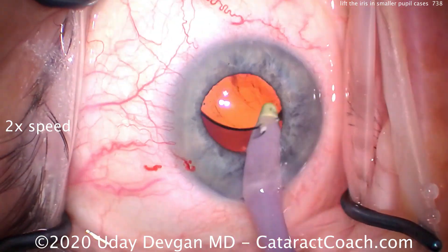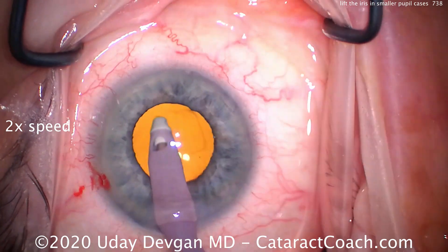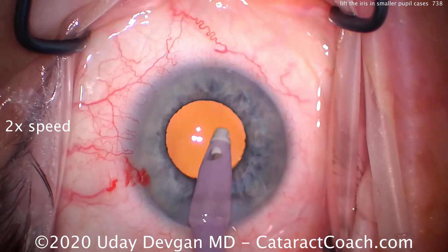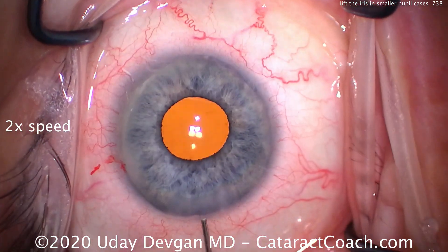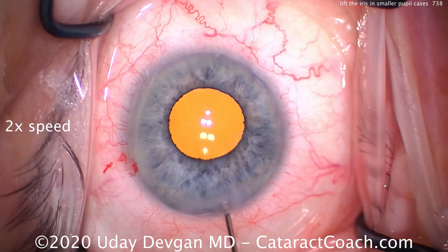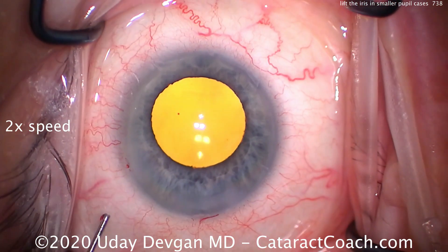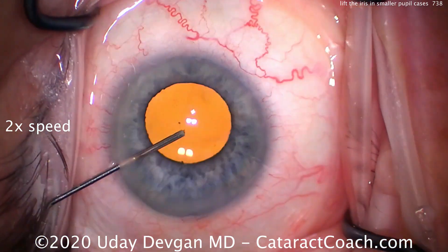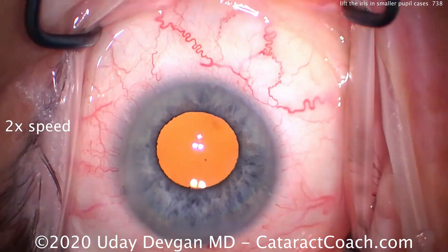At this point we can go inside with the IA probe, remove our viscoelastic, go behind the optic, clean everything out, and it will look great. So keep this technique in mind — it's a very important tip for patients where the pupils are adequate but not very dilated. There's still a lot of room where cortex can be hidden, and in addition the IOL could be misplaced and not fully in the capsular bag. So it behooves us to really check and make sure.